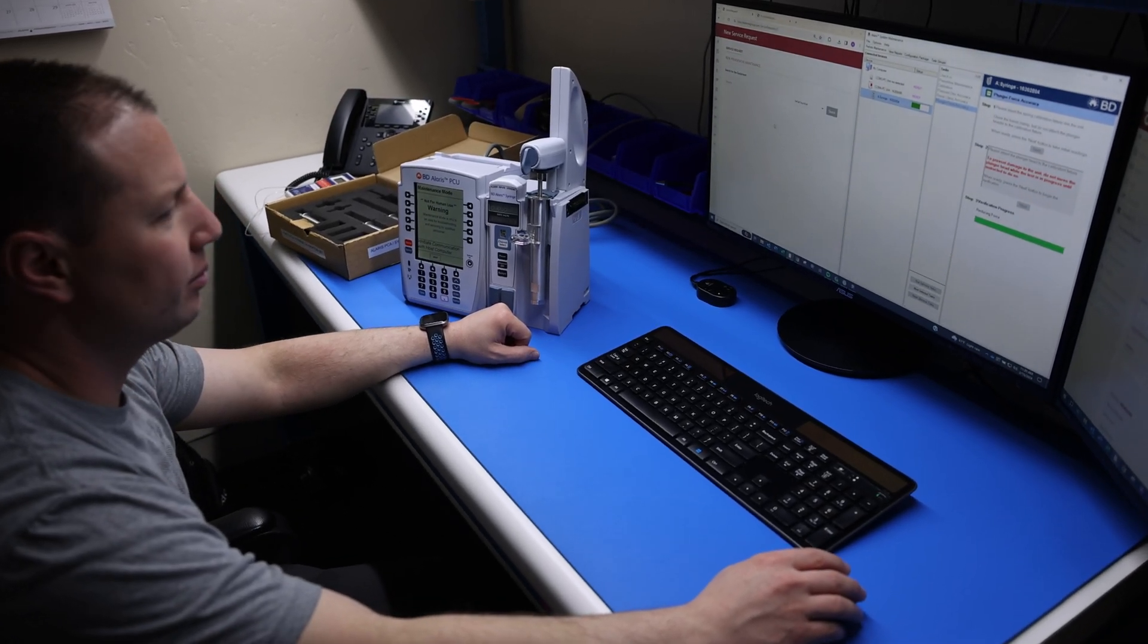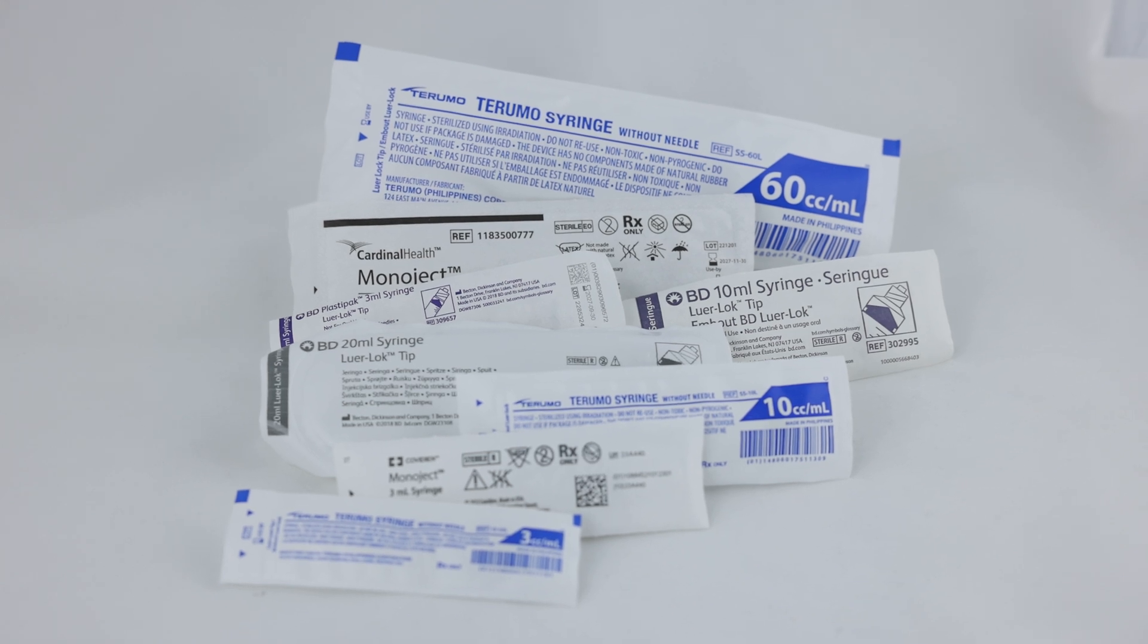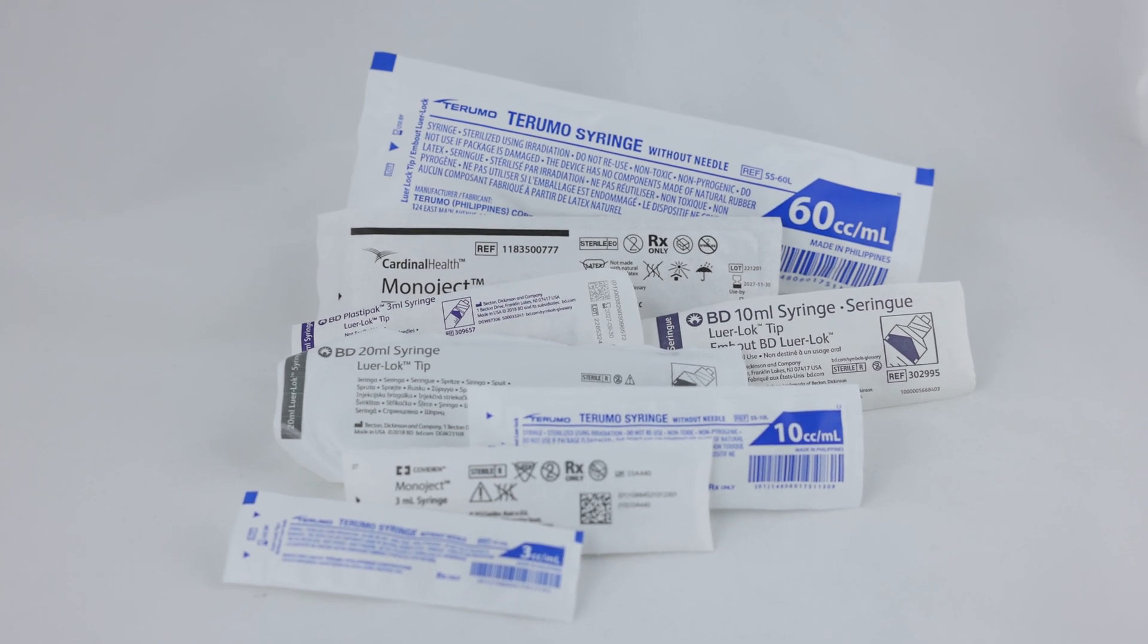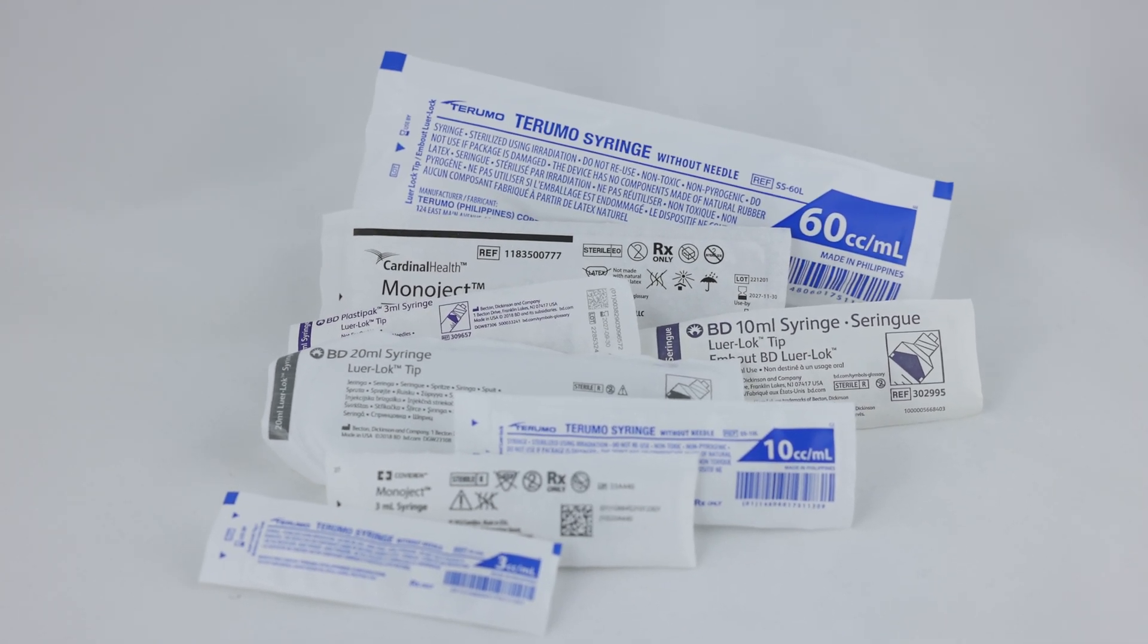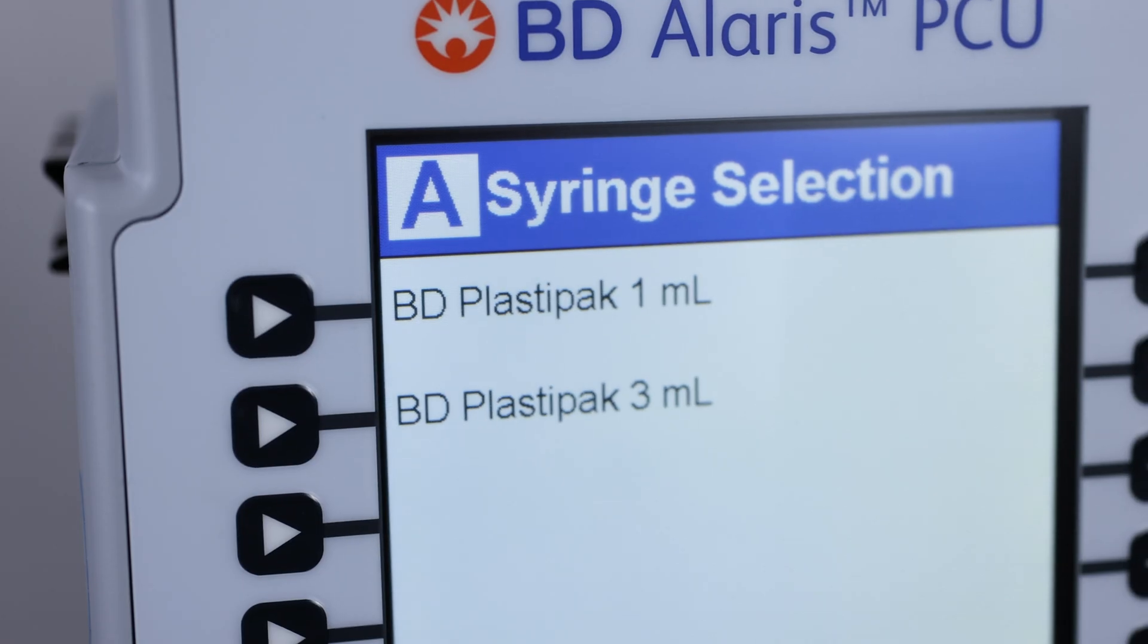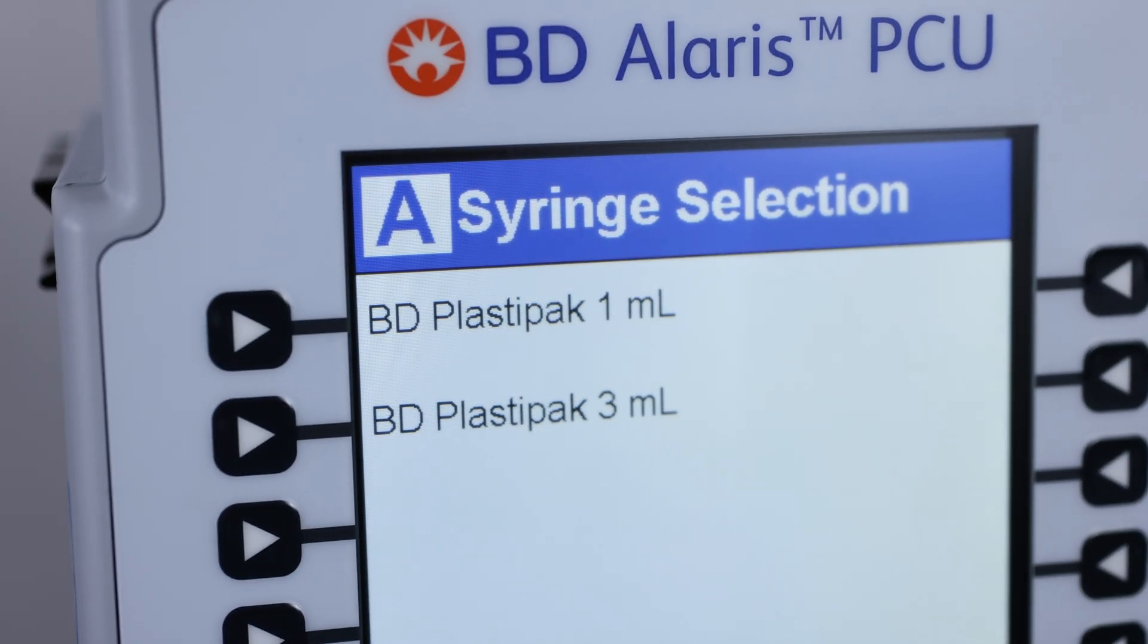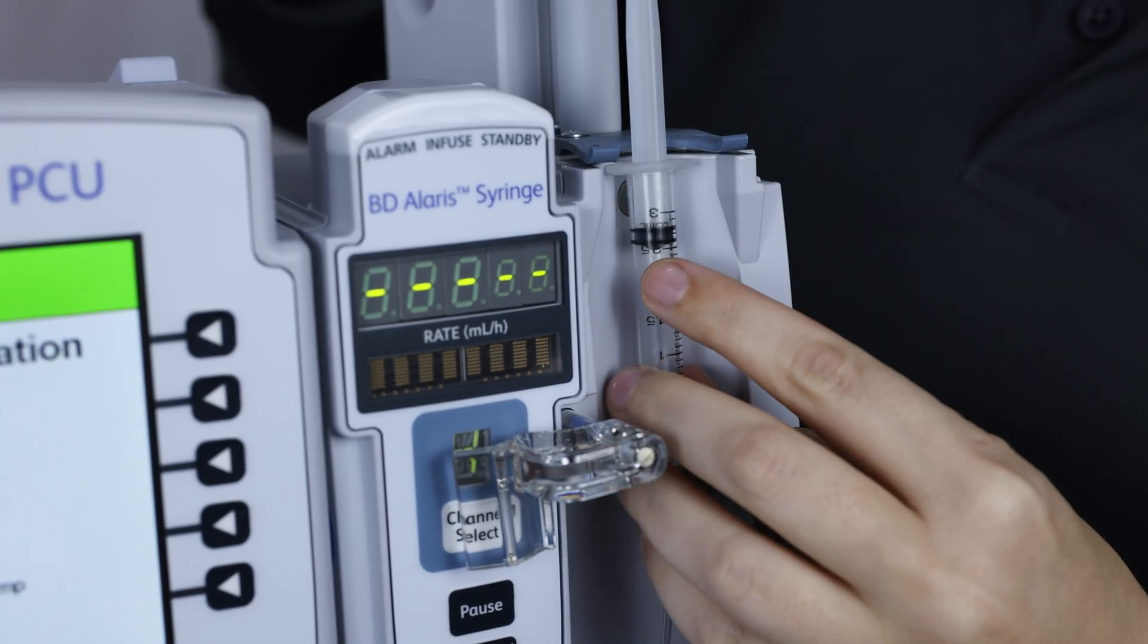Acceptable syringes to use with the 8110 syringe module include those manufactured by BD, Monoject, and Terumo, ranging in size from 1 milliliter to 60 milliliters. The pump module has an auto-detect barrel clamp that senses the size of compatible syringes.